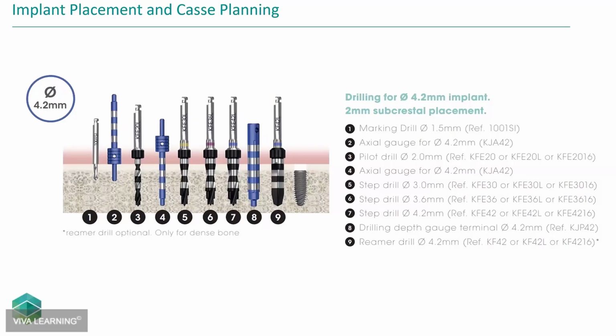So super quick, I don't want to assume that everybody knows the basic protocols of implant placement. The basic protocols, I won't spend too long on it, is you start your pilot drill where you think you need to be. You move your way up a sequential order of drills, getting larger and larger. And at the end, you're at the right place with your osteotomy drill. You put your implant in at the depth that you feel is necessary.